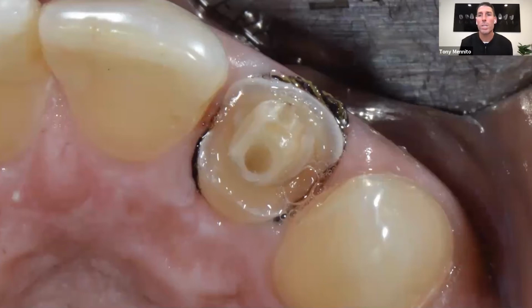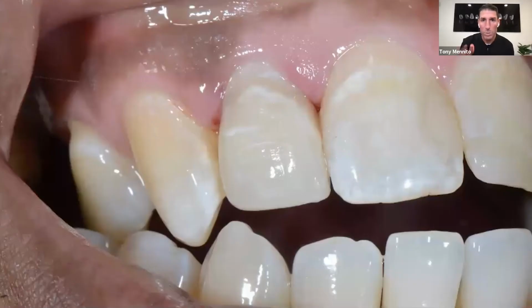You wouldn't prep this aggressive for emax, but for Empress, and this was a few years ago, a dental student did the case. This was our preparation, and this was our final result on that lateral incisor number 7. So Empress with the built-in gradient, and I'll talk about that in a little bit, with a little bit of staining and glazing, really is a beautiful, beautiful restoration.